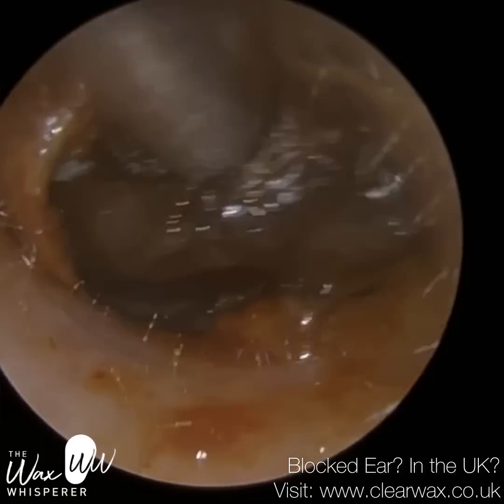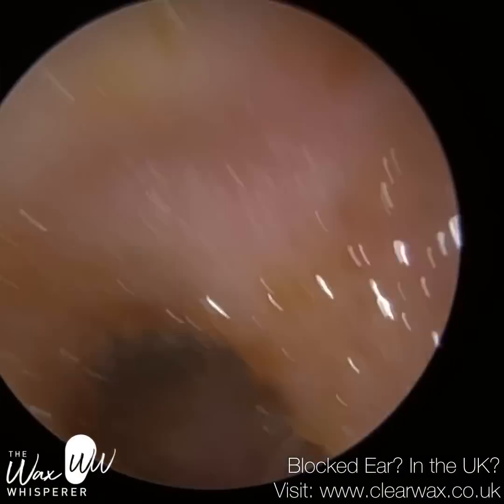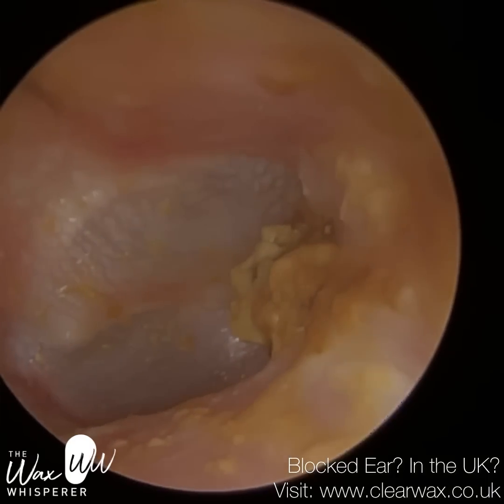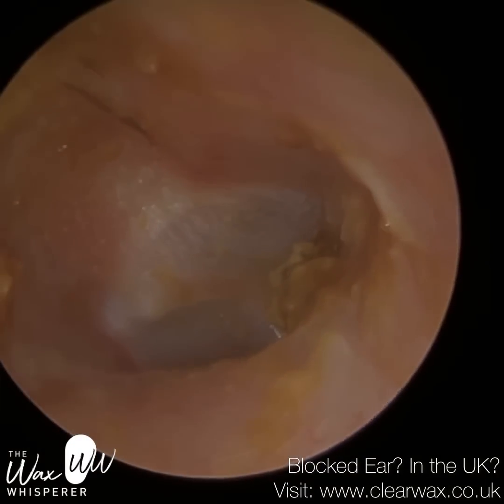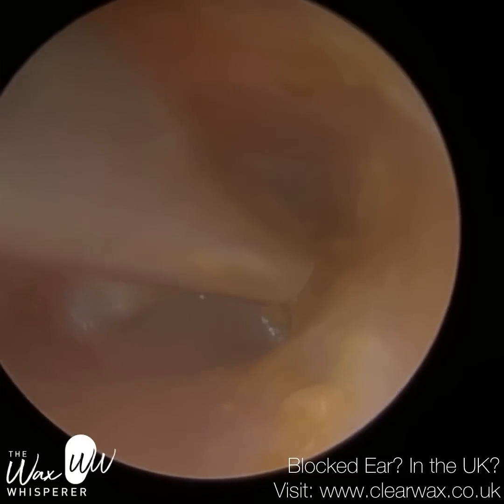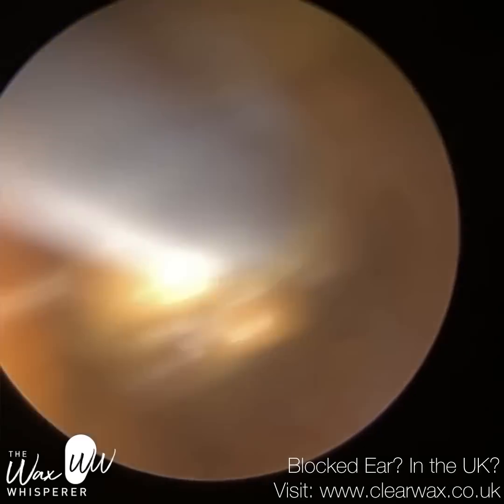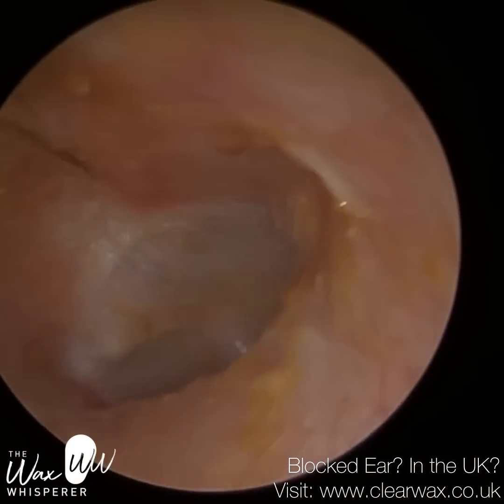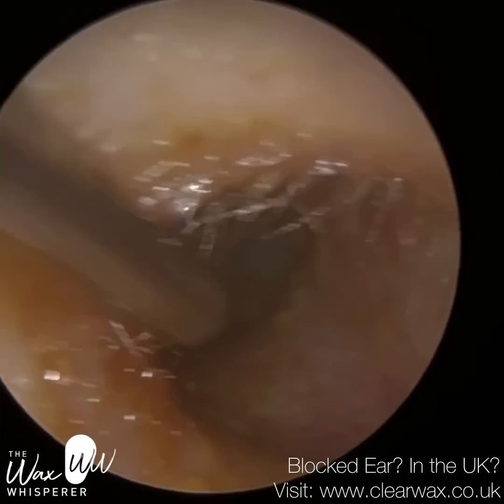You can see just how much of a wriggle I'm having to apply here, and in part that's because this wax plug is enveloped by some dead skin. You may have noticed also at the entrance of that ear there is quite a bit of a dip. It's a subtle dip. It goes down and up again. Most of our adult ear canals have a natural upwards trajectory of around 32 degrees, but in this patient there's a preceding dip, and it goes back up, and it could be that the wax, as it's trying to migrate, is falling into just there at the bottom. It gets trapped in that little divot, and then it can't come out of it, so you get a build up.